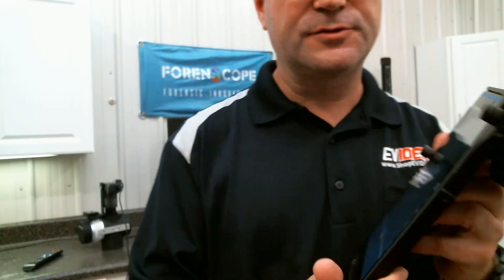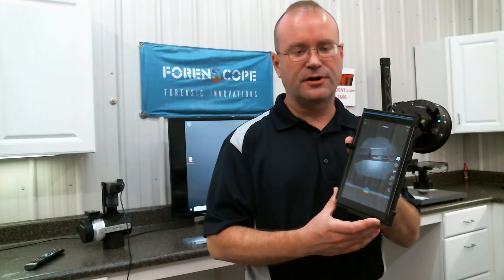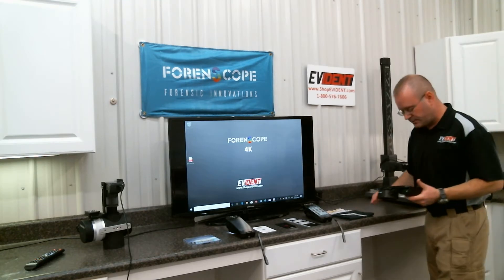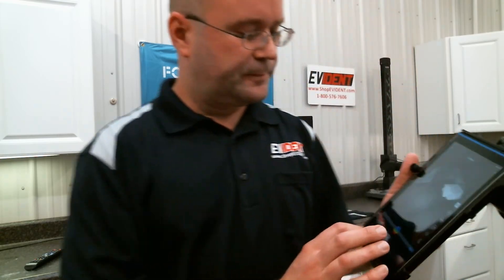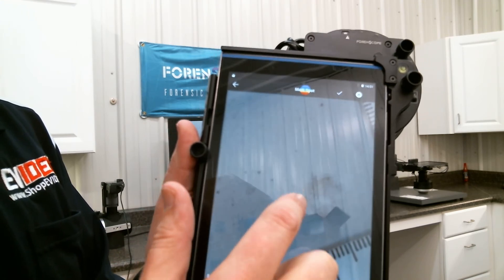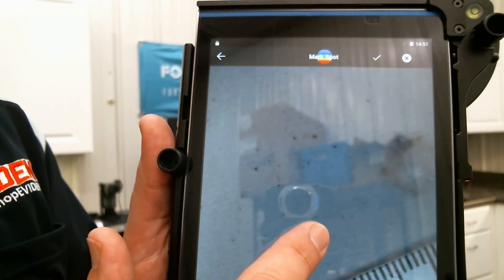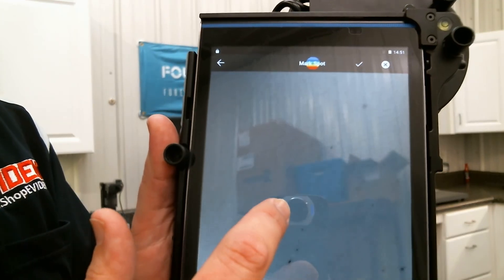The infrared setting is really what makes this device stand out above all others. It gives me the ability to locate blood and GSR at the crime scene and in the laboratory. We've got some GSR on this fabric here. I can search the surface. What you can see here is the entry point of the bullet, right here, and you can see bullet residue around the entry point and the GSR particles around that. So you have the ability to visually identify GSR as a presumptive search tool.